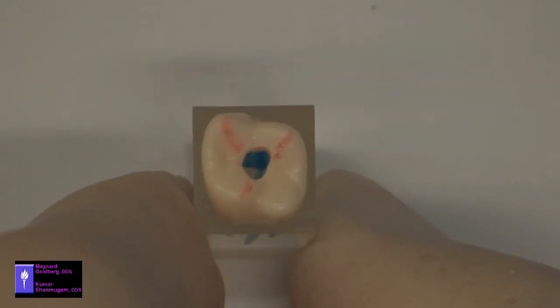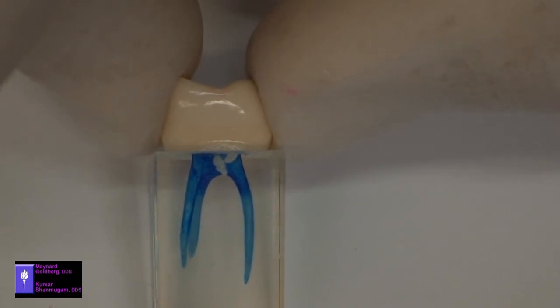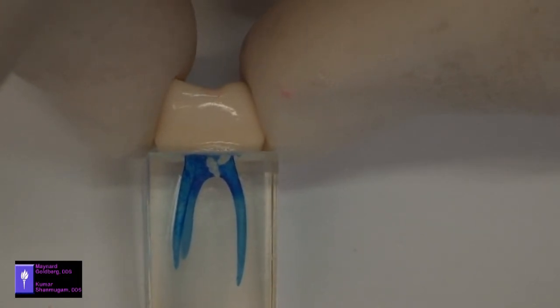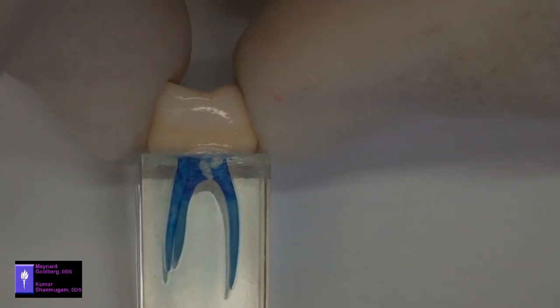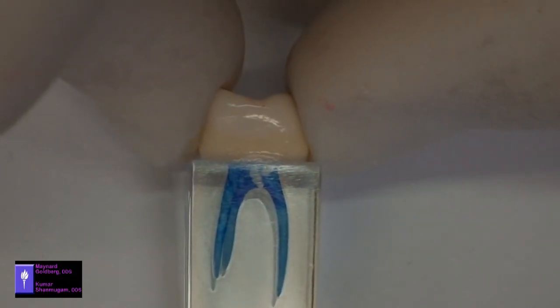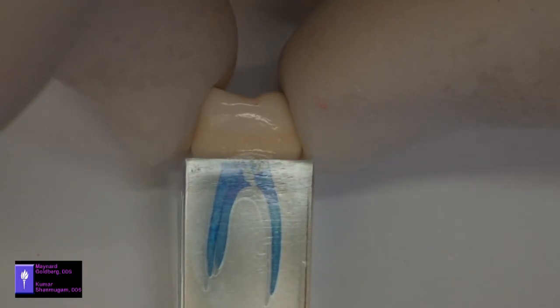This is an access cavity that is obviously too small and would not allow for unimpeded movement of the files that would be used to clean and shape this canal. This is an access cavity where penetration of the floor of the chamber occurred. This generally happens when one presses the foot pedal and just lets the burr go indiscriminately. And as you can see, it happened in several spots on the floor of the chamber.